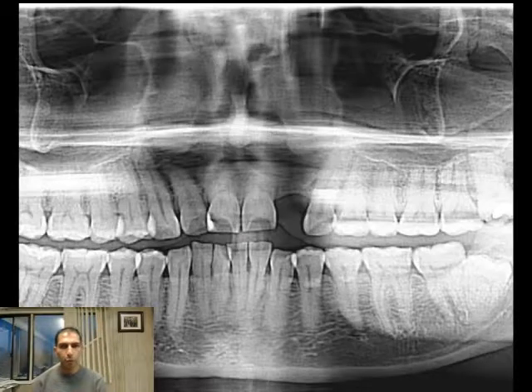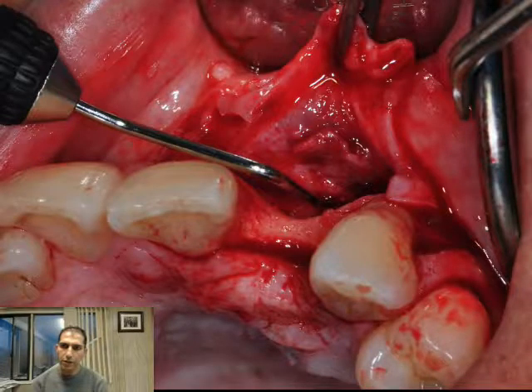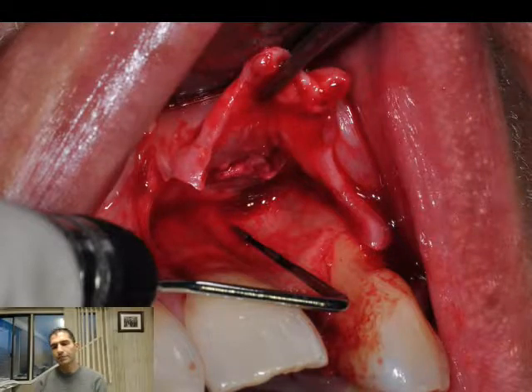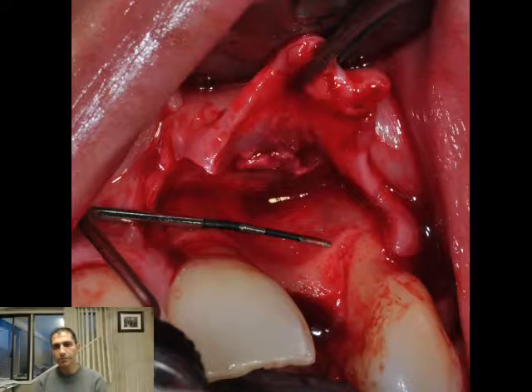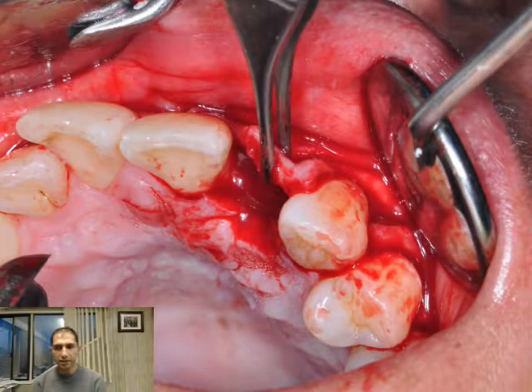We're going to use an autologous bone block to augment the bone. This is the x-ray and this is my incision design — a remote incision. We're going to measure here, and we're going to measure twice. You can appreciate the amount of bone loss.